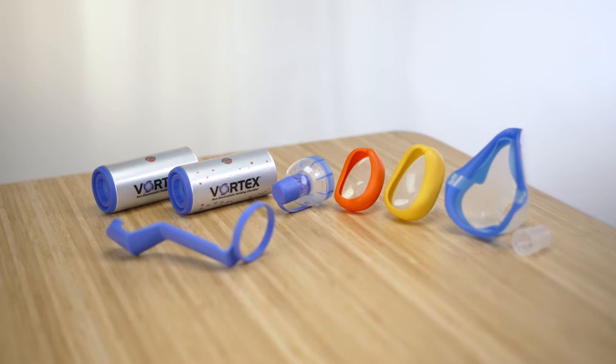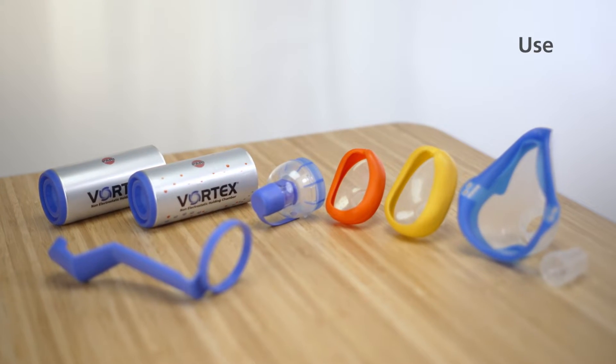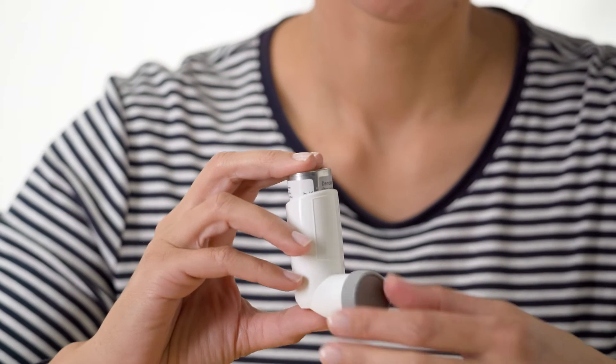To ensure reliable metering and very good aerosol performance, we recommend the following steps. Wash your hands thoroughly before each inhalation session. Shake the metered dose inhaler and pull off the cap.